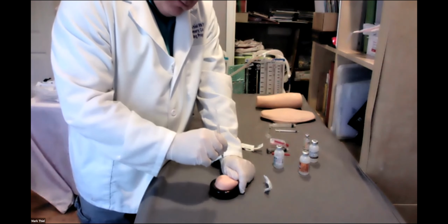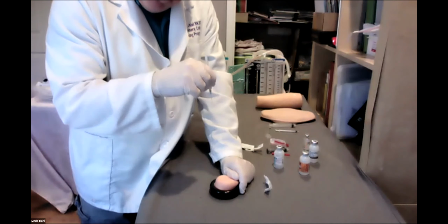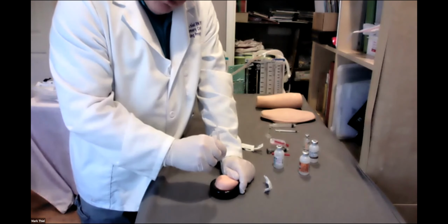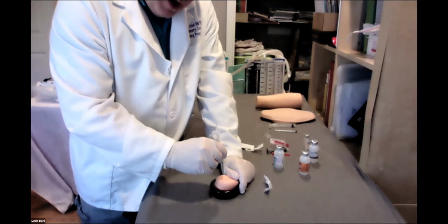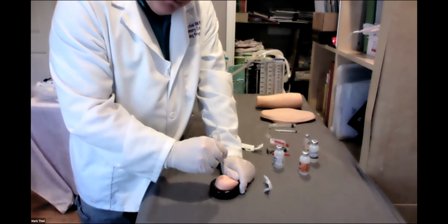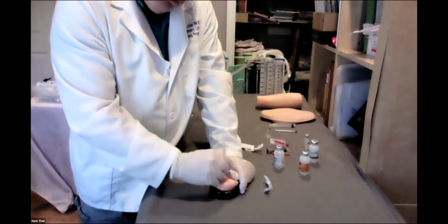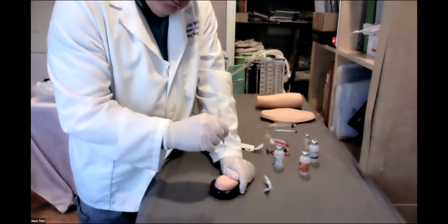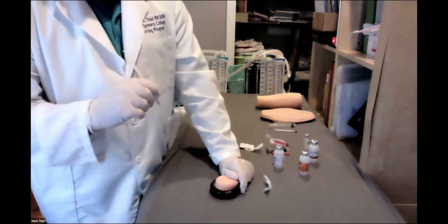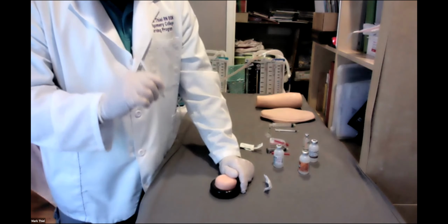Now speed: about 1 to 1.5 inches above the skin surface, not up here and going like this. Boom. We're down about 1 to 1.5 inches above, and crisp and confident, dart it in. Crisp. Quick. Get it in there.